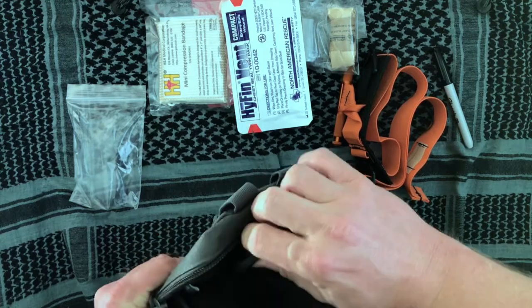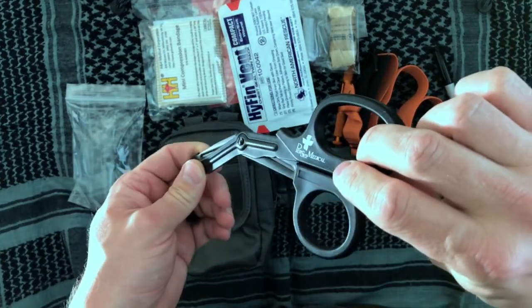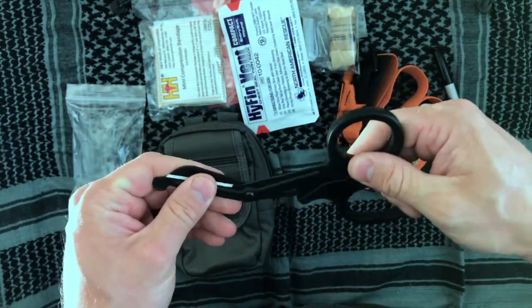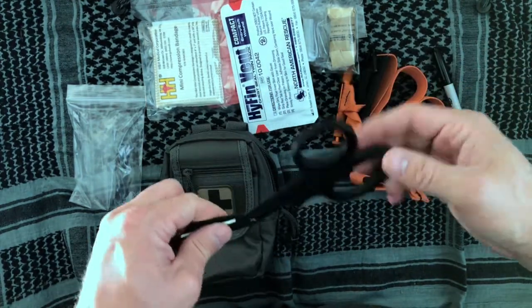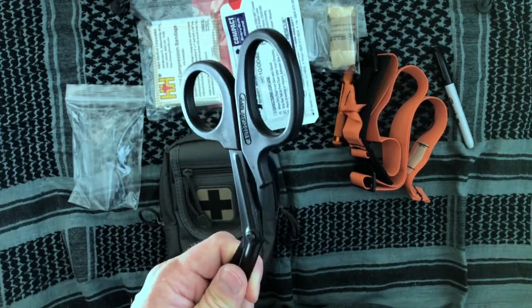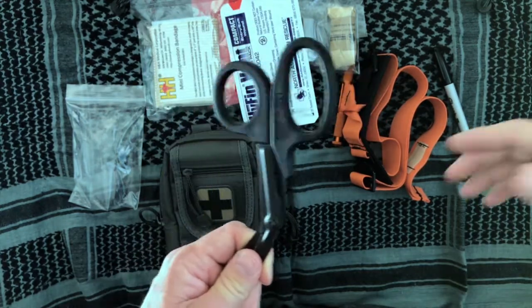And lastly, you've got some trauma shears, and these do not feel like your everyday Walmart special. These are a little more stout — there's no give there. They're a decent pair of shears, and they allow you to quickly remove clothing, especially in a wound scenario where you're not just doing CPR but actually dressing a wound and need to get that clothing off and away from the subject.